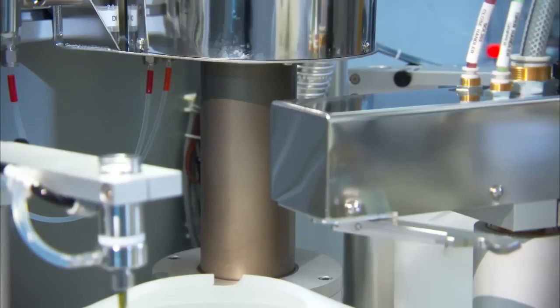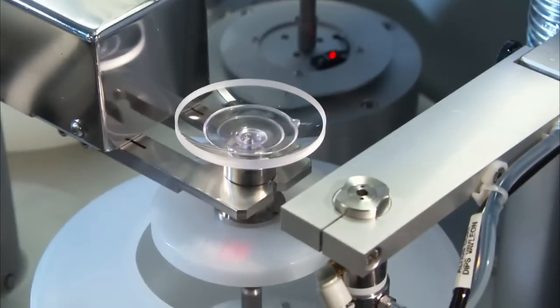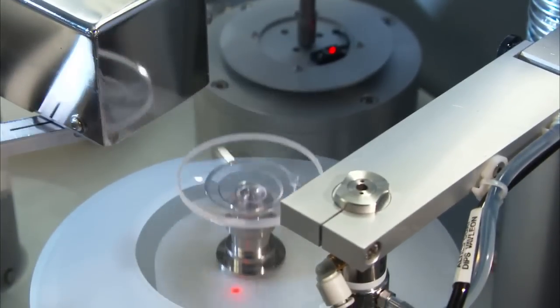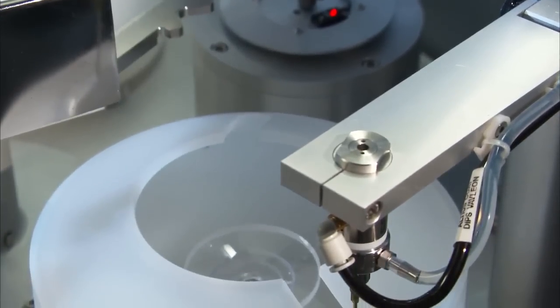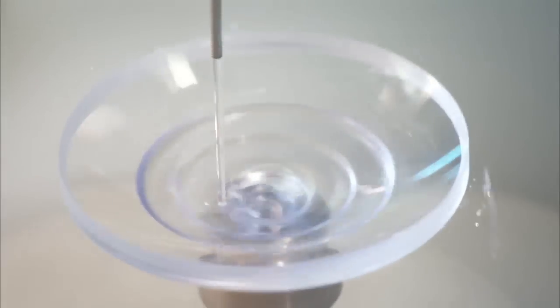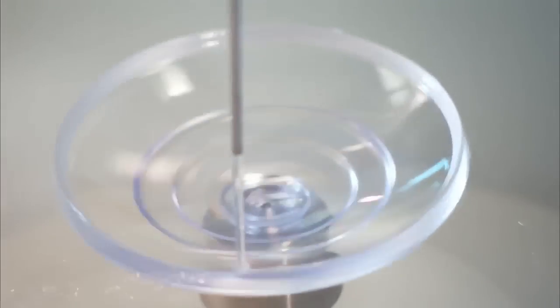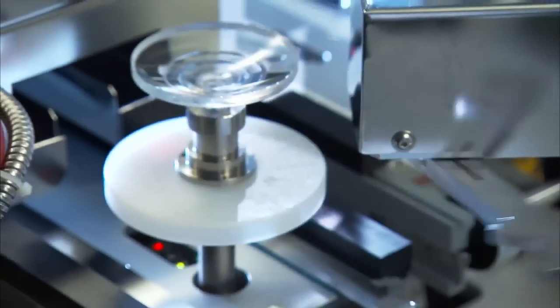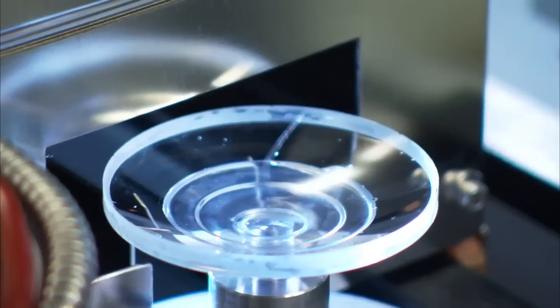It then undergoes a curing process. Next, the hard coat layer with 50% silica particles suspended in a polymer matrix is applied in a spin process. The lens is then moved into a curing chamber, where the hard coat curing is completed.